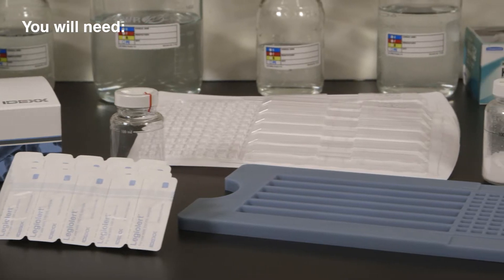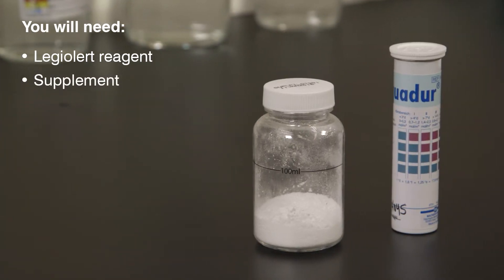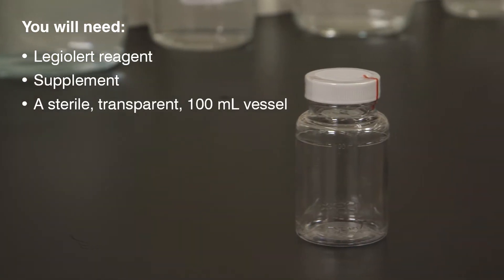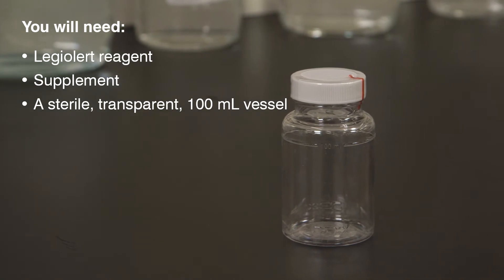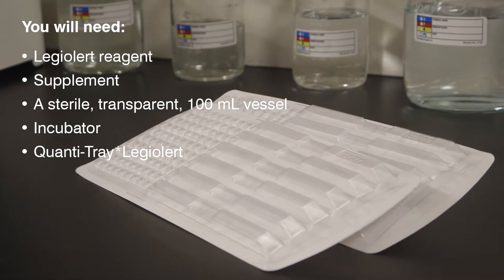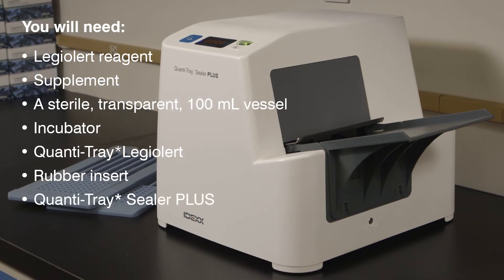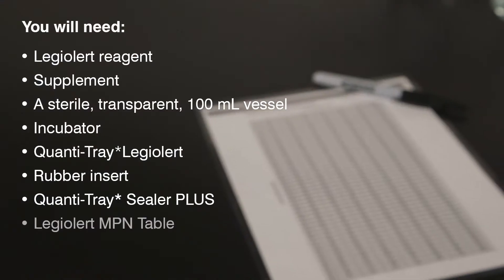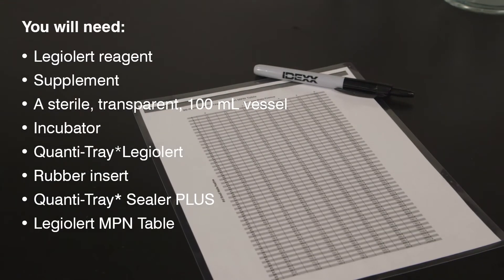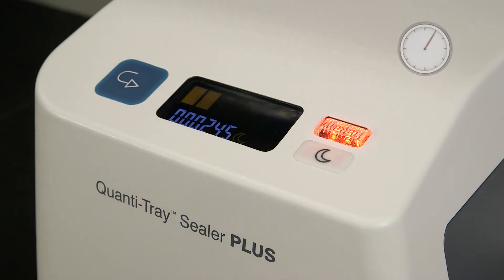You will need the LegiAlert reagent, the LegiAlert supplement kit, a sterile transparent 100 ml vessel, an incubator, a Quantitray LegiAlert tray, a Quantitray LegiAlert rubber insert, a Quantitray Sealer Plus, and the included Most Probable Number table or the IDEXX Automated MPN Generator Program found at IDEXX.co.uk/water.